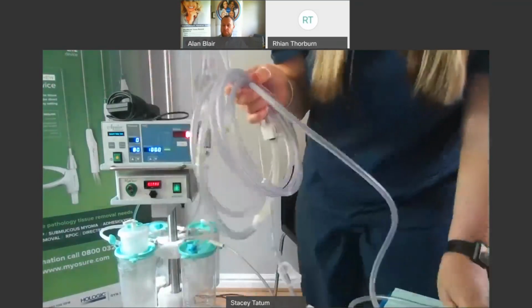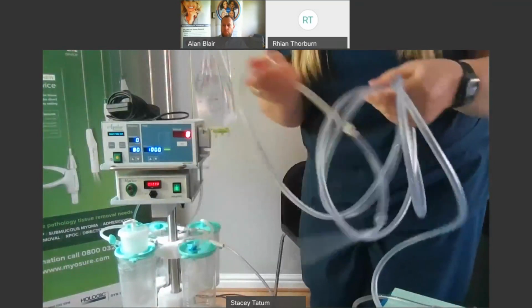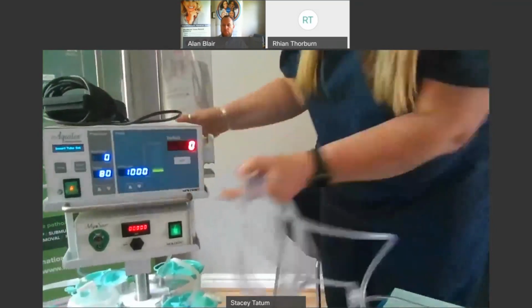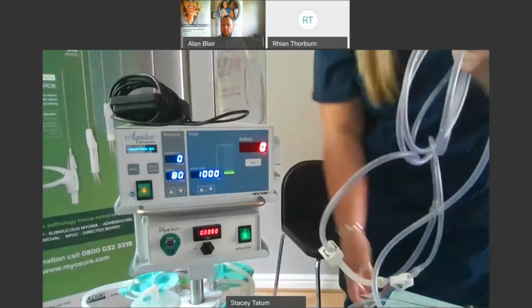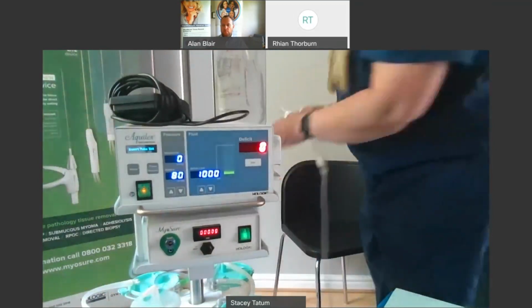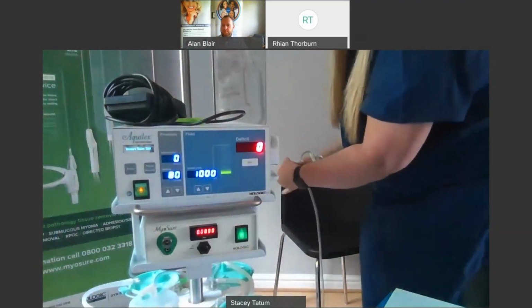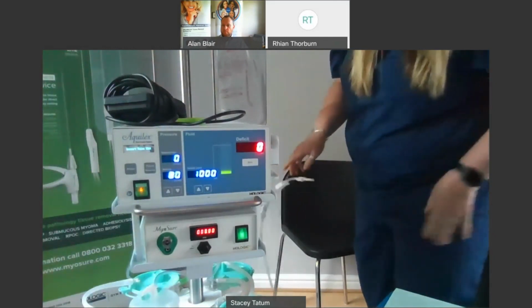So to connect your inflow, the machine needs to be on. It needs to have done its systems check, and it needs to be asking for the tubing. So I'm just going to wheel that forward for you so that you can see that the system is asking for the tubing. So I'm going to clamp both my clamps off. I'm then going to spike my bag with just one clamp. Okay. And then I'm going to open that clamp because the machine will take hold, but I'm going to keep this one clamped off.